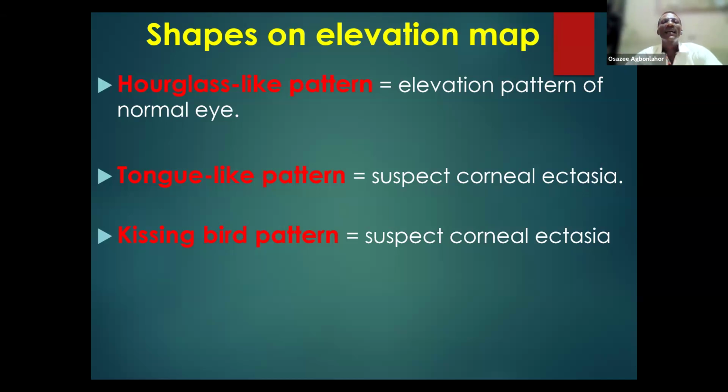It's not until I handled or saw a printout like this in my former office, we used to have one, and we used it, and that was when this became more real to me. And I think this is one of the reasons why a lot of us are not very familiar with these concepts. However, just work with me as we move on.